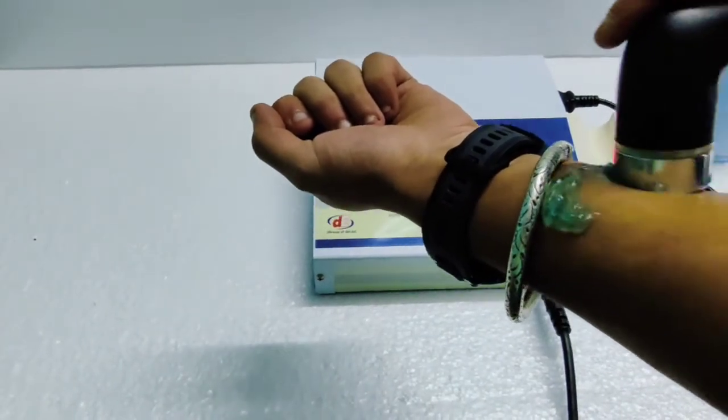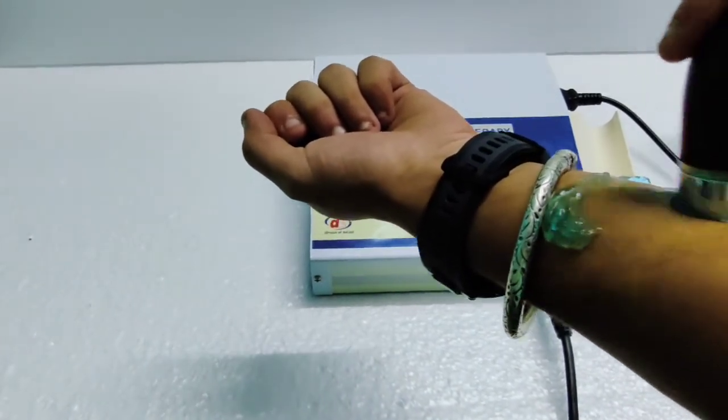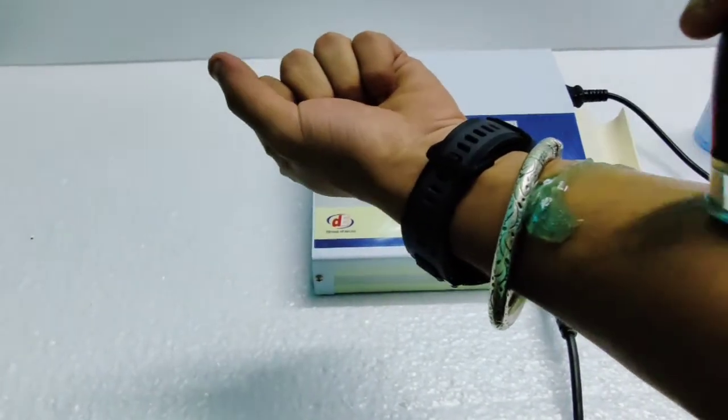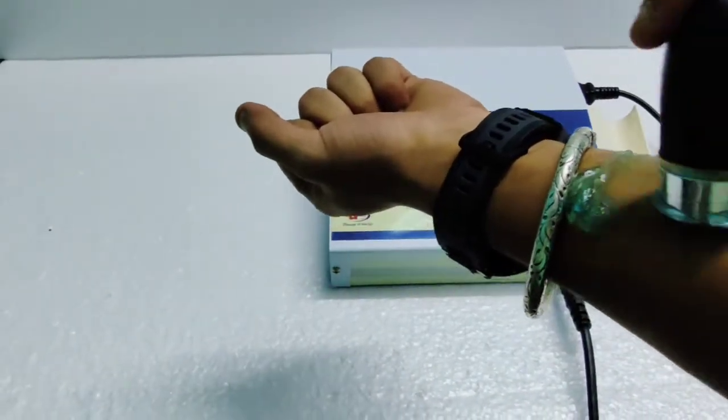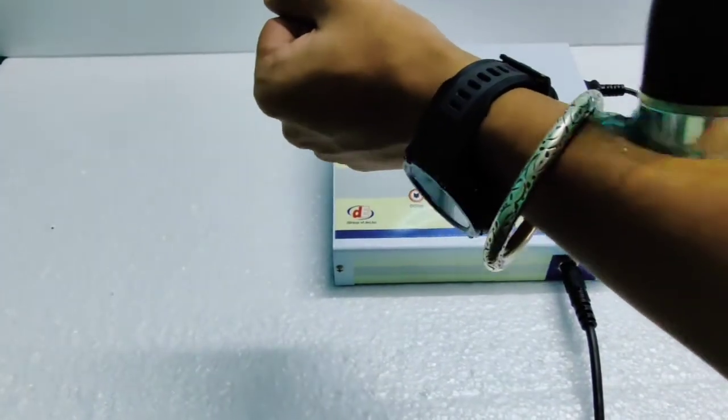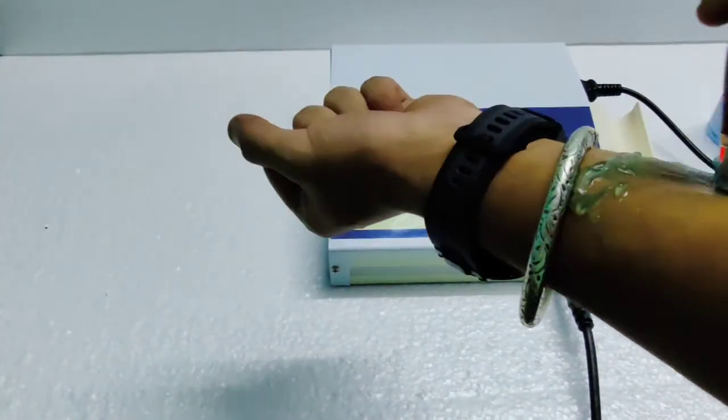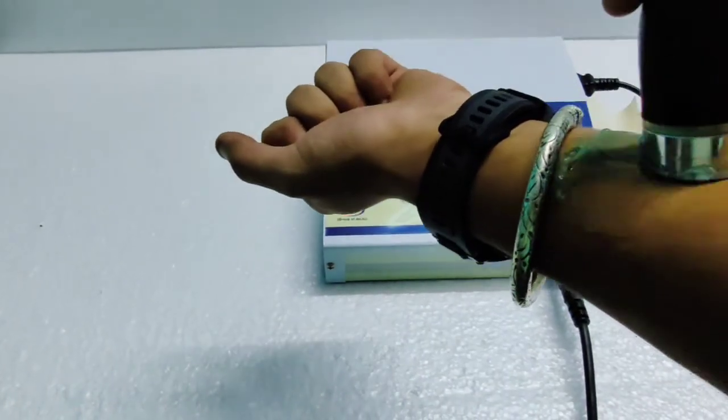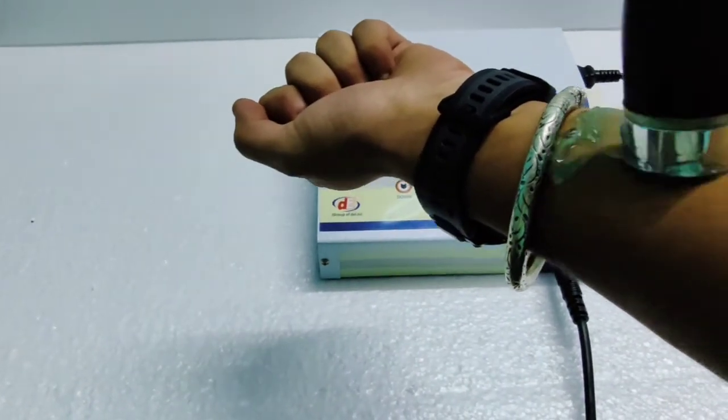Now it's going to give deep heat massage to your muscles and release your pain. You can choose time as per your choice and you can use it on any body part where you feel pain, like this.